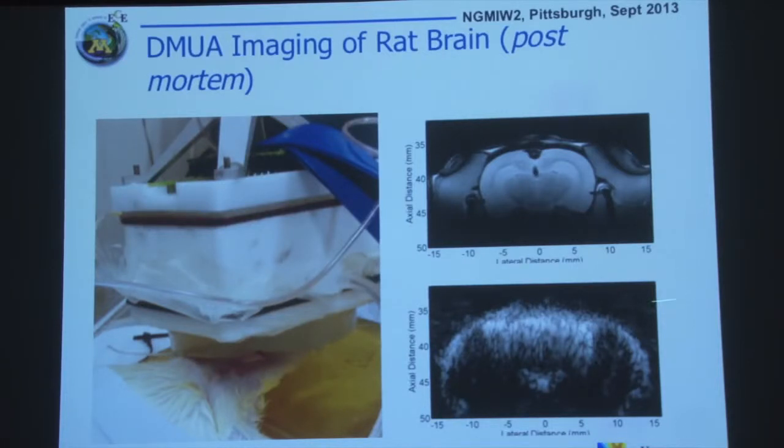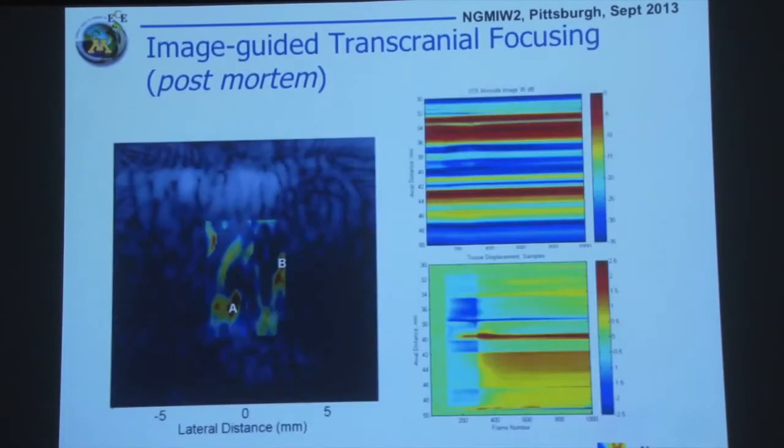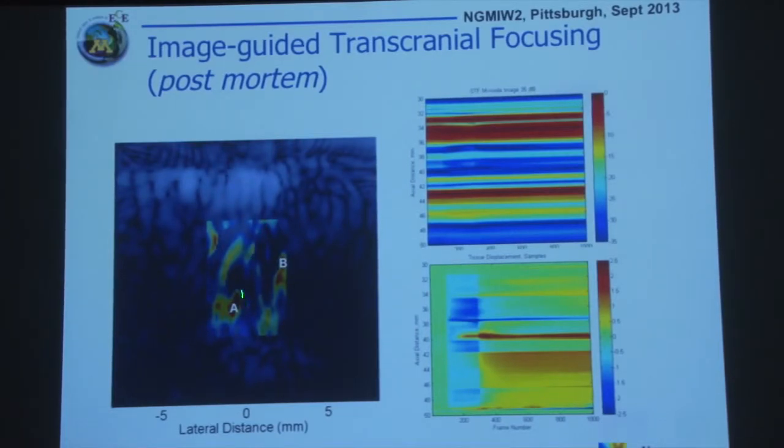Again, my hope is that this image will become much more informative as we go forward, but the objective of these experiments was just to see that I can pick up brain tissue echoes and know that I'm getting data suitable for speckle tracking, for example, and so on, for localizing therapeutic effect. So what we did here is focus at around this point, geometrically, the array, and this is a synthetic aperture, what we call a single transmit focus image. So this would be the skull. It's even more limited in terms of field of view, but it's very useful where you're trying to focus. So this is where we're trying to focus. The beam shifted a little bit.